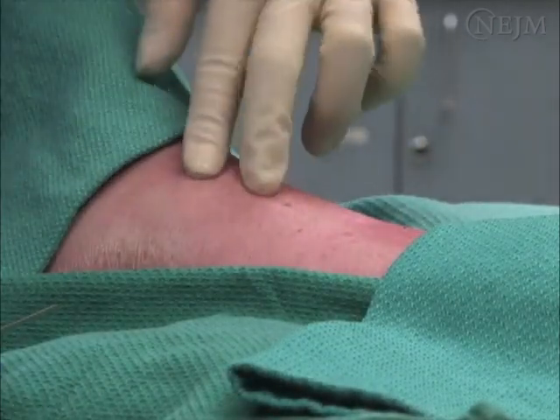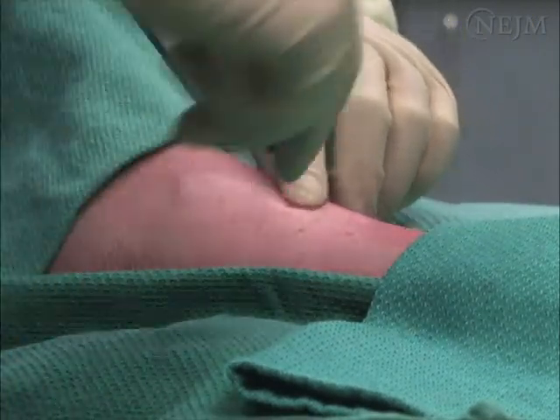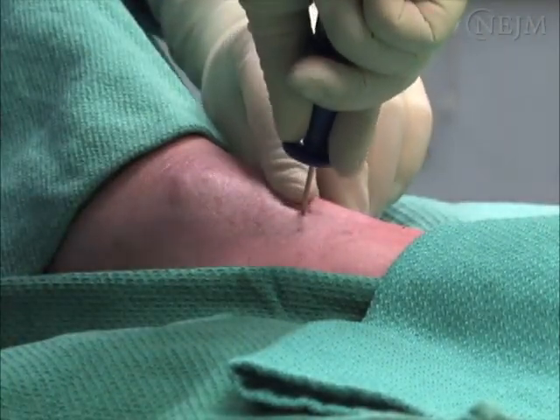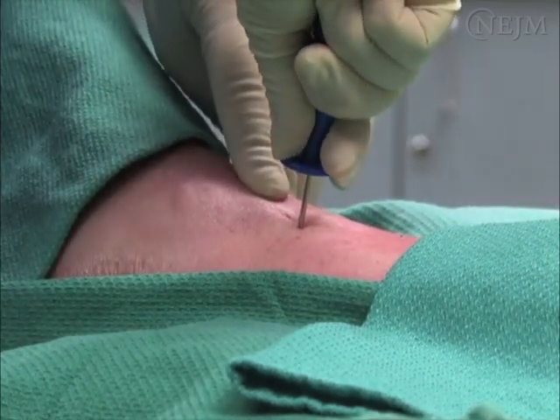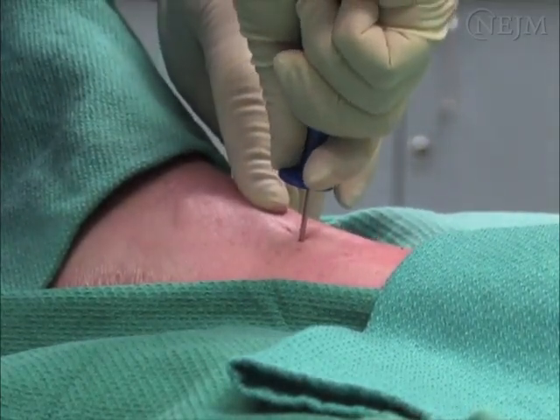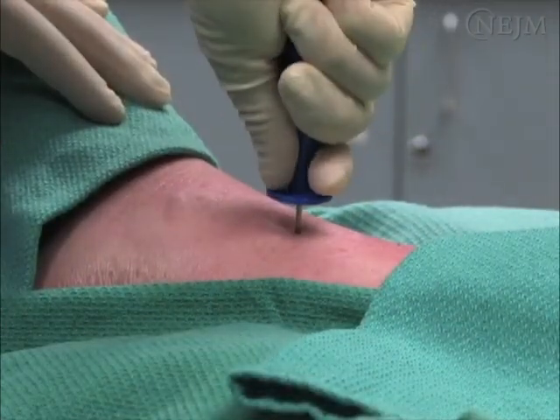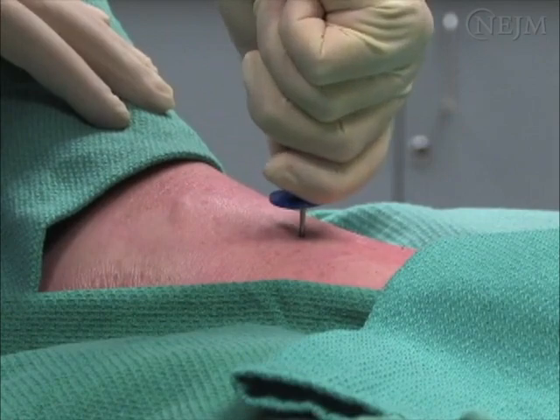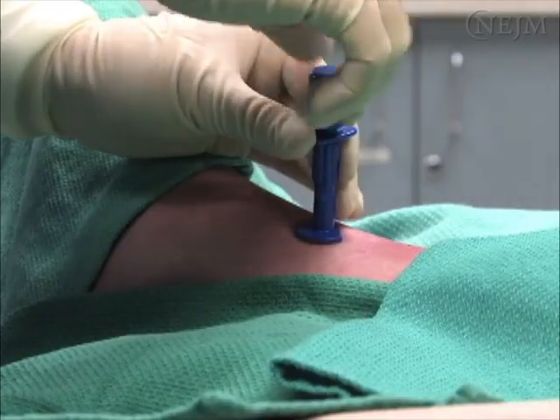Hold the needle in the palm of the dominant hand and position it at a 90-degree angle to the long axis of the bone. Advance the needle through the bony cortex with a twisting or rotating motion and steady pressure. You will encounter a great deal of resistance. A sudden loss of resistance indicates that the needle has penetrated the cortex and reached the medullary cavity.